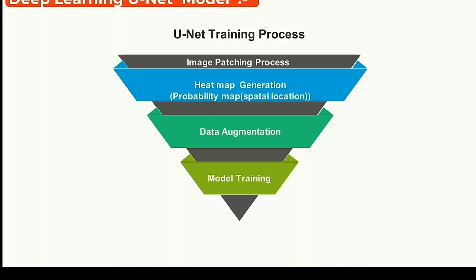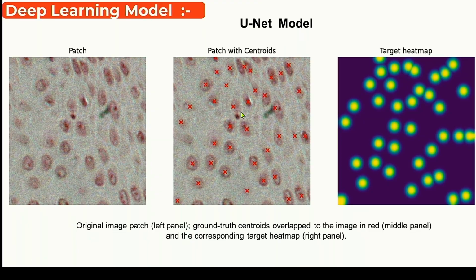There's a threshold and a diameter determined by experiment to detect the best cells, and we get a good result using that, okay? And then we do augmentation for the data and feed the model with data, and we have a good result in that.